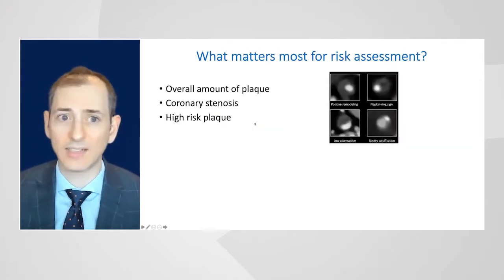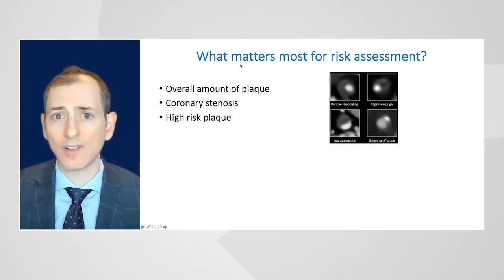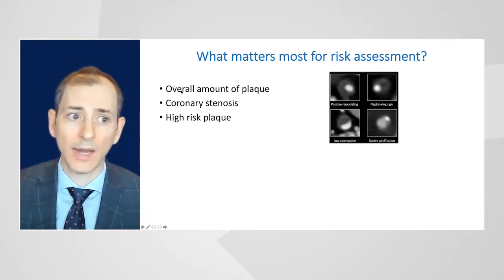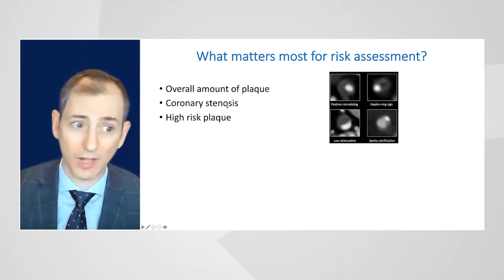So the next topic I want to speak about is what actually matters the most for risk assessment. A lot of what we're going to talk about today is risk assessment. And I already hopefully showed you that the amount of plaque matters, and certainly stenosis still matters.